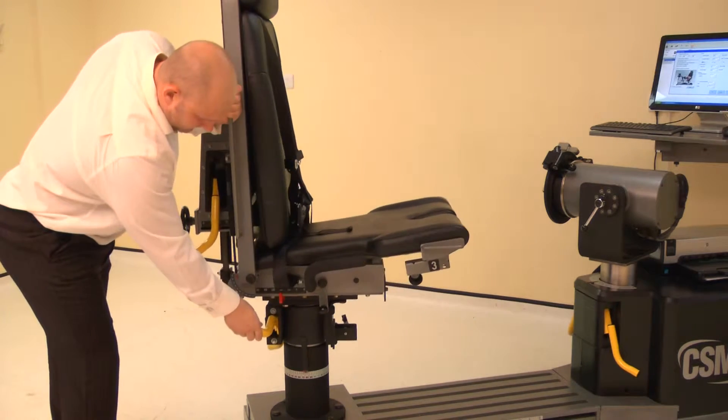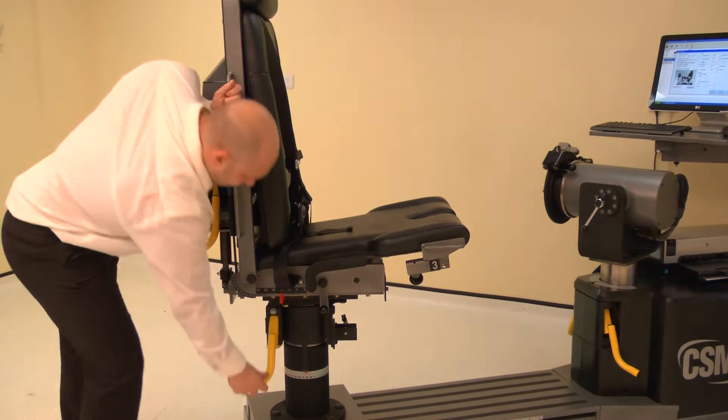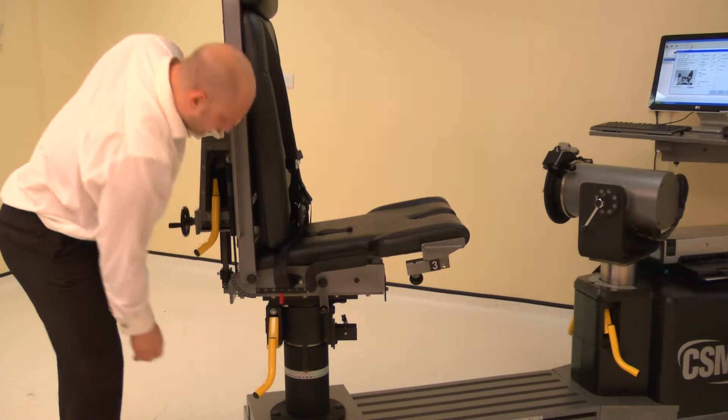Lift a locking handle and rotate the chair to 35 degrees on the black scale. Ensure both locking handles are pushed down to secure.